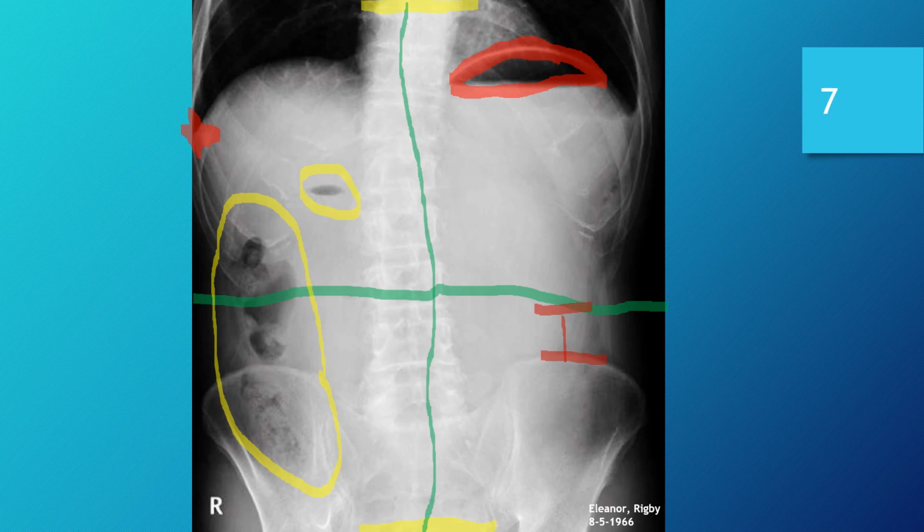Moving on to number 4, does the image demonstrate any artifacts? No, I cannot readily identify any artifacts in this image, external or otherwise. I don't see any skin folds, or perhaps one area right here along the inside of the cursor.